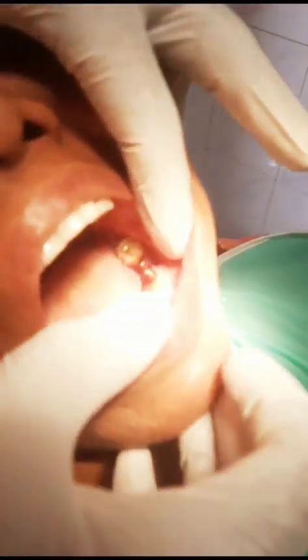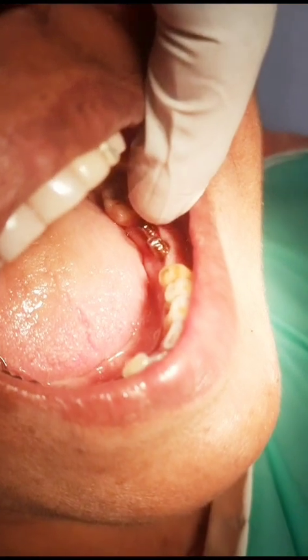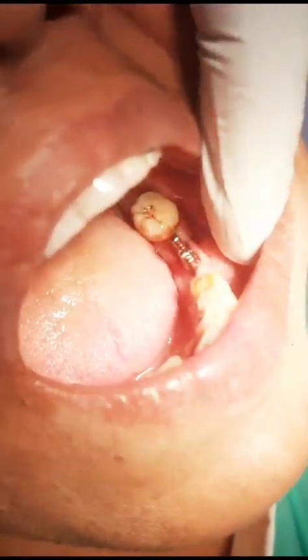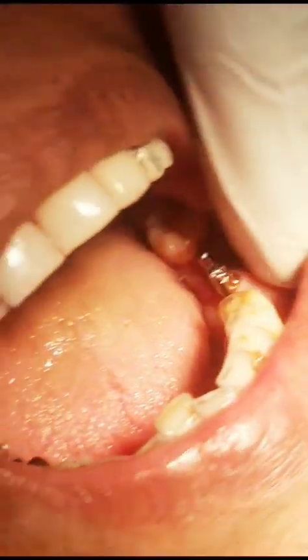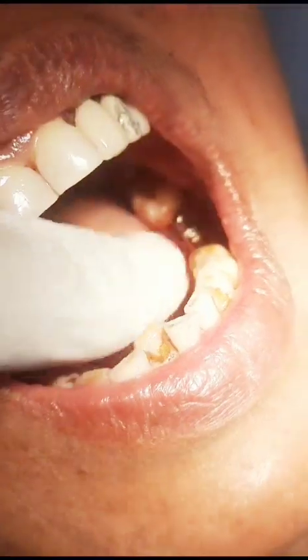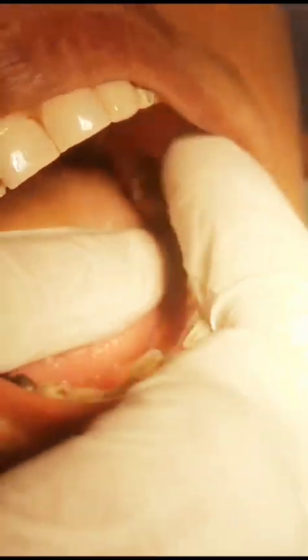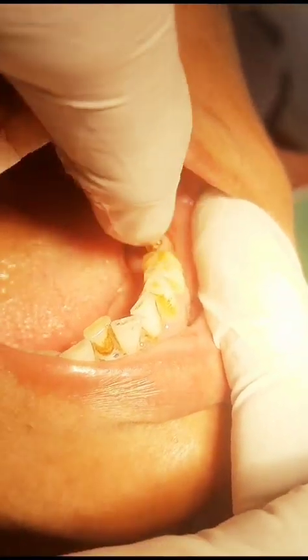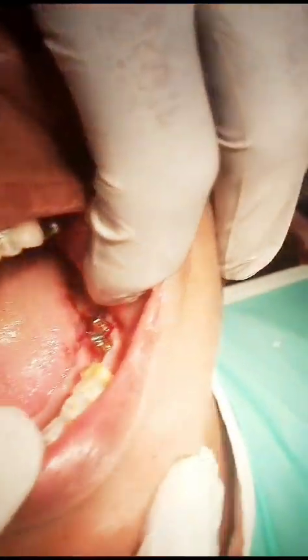The patient wanted implants in the region of 35, 36, and 37. I placed two 3.5mm implants of 16 and 18mm. I first tried to place them on the lingual cortical but did not succeed much, so I did it on the buccal cortical. The implant was placed obliquely, and from that angle I straightened it. Ultimately you can see these two implants are looking parallel to each other — it's very clear they are parallel.